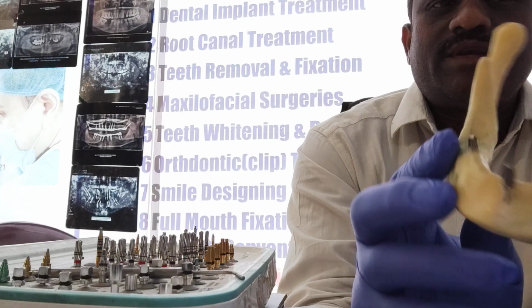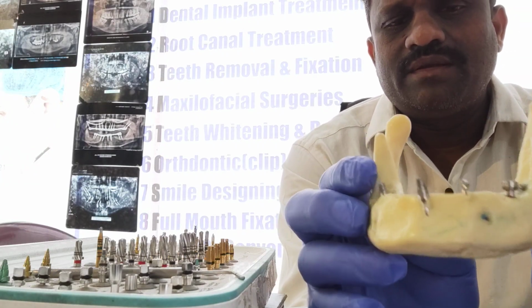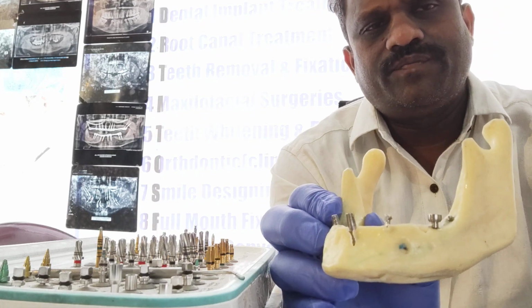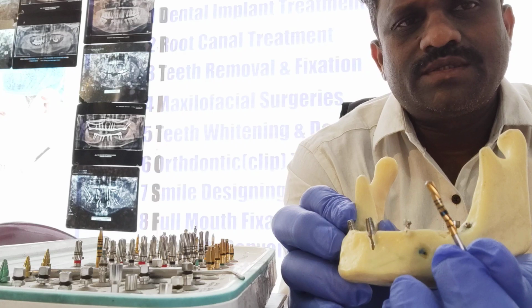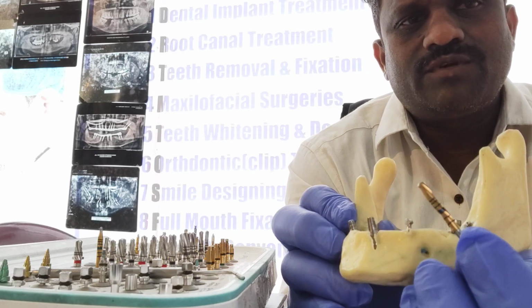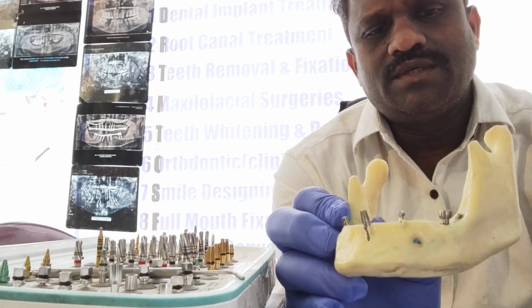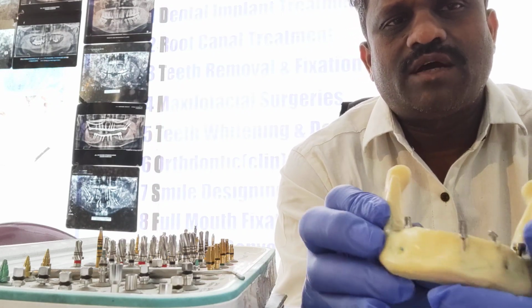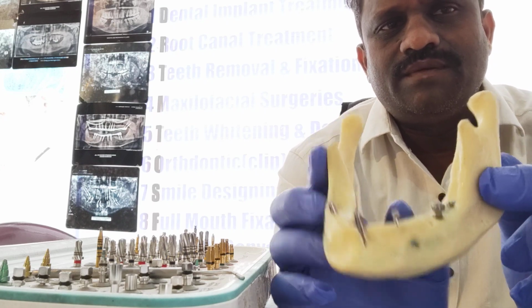So that is the brief explanation about placing the implants in the mandible. Okay, so this is one drill which I have used. This is a twist drill of 2 mm diameter. This is used after the pilot drill. So this is how you place your implants, bicortical implants, in the mandible.